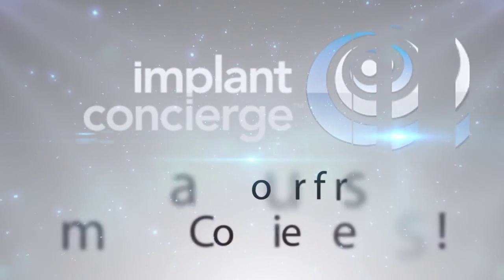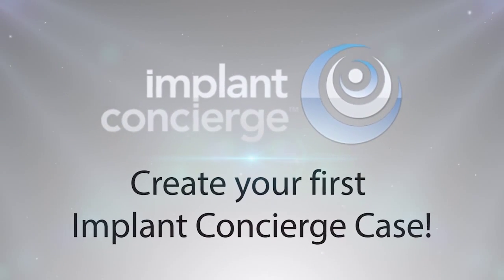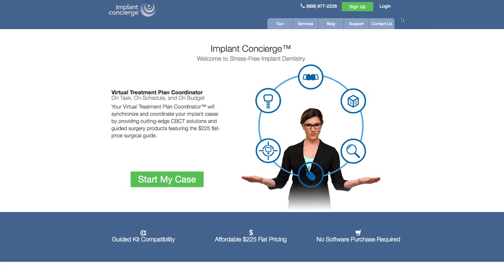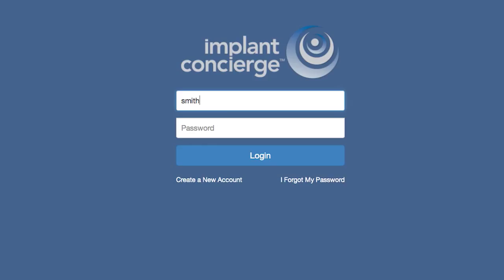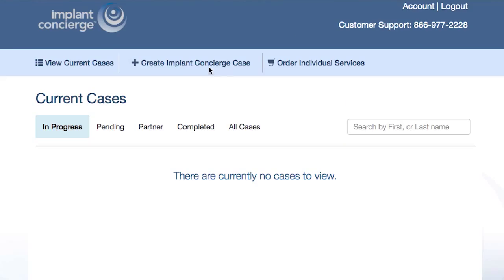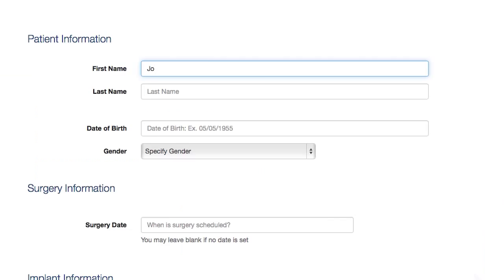Creating your first case with Implant Concierge is fast and easy, whether it is a partially edentulous or fully edentulous case. After you have signed up, simply log in using your email address and password. Select Create Implant Concierge Case and complete the Patient Information section.